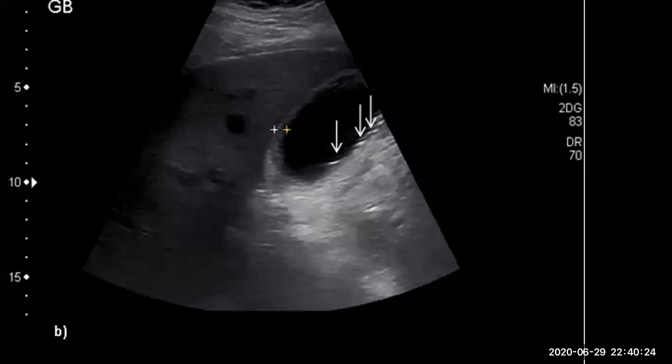And here is a calcified gallbladder wall. Porcelain gallbladder. These are the real shadows, the stone and the wall. And the stone also, in daily work, you have the stone.